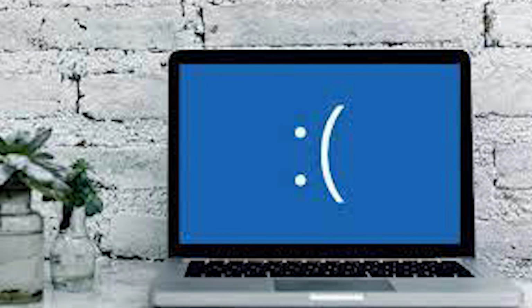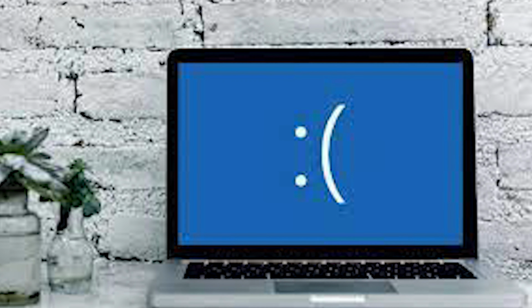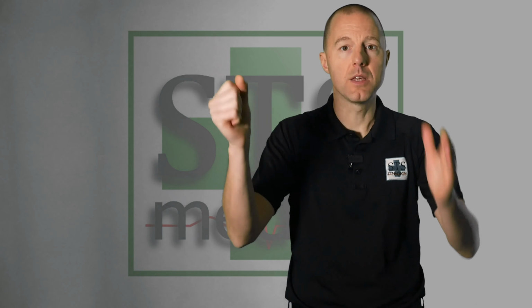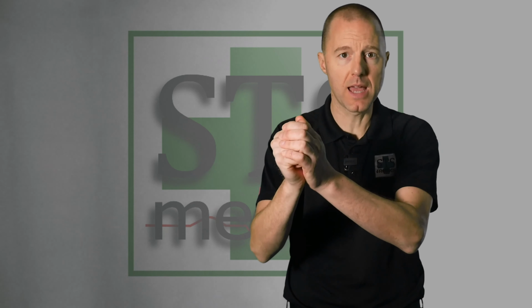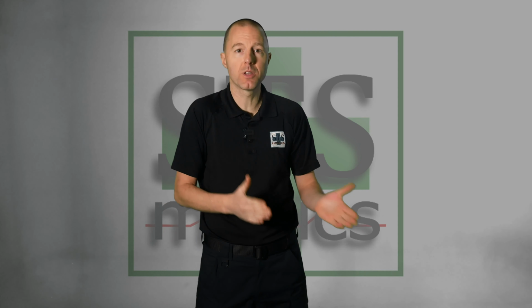A little bit like when our laptop freezes. We don't get a screwdriver out and fix it. We simply turn it off and on again and let it restart itself. This is very similar to how an AED works. The heart is beating normally, and then when somebody has a heart attack, the heart goes into that quiver I mentioned earlier. The AED shocks the heart to stop it dead so that it has a chance to restart back at a normal rhythm.